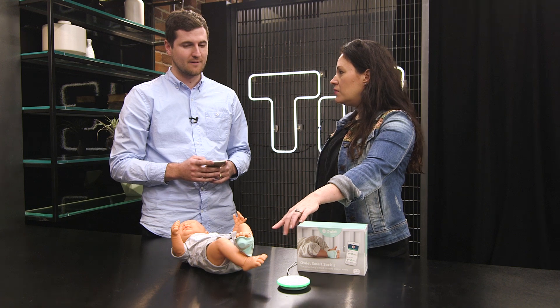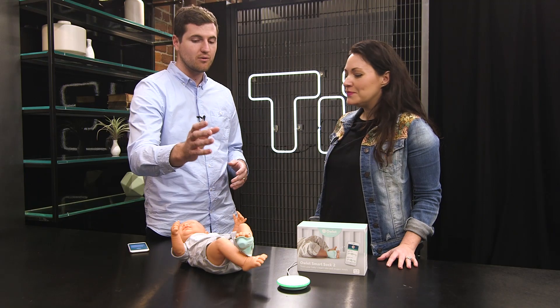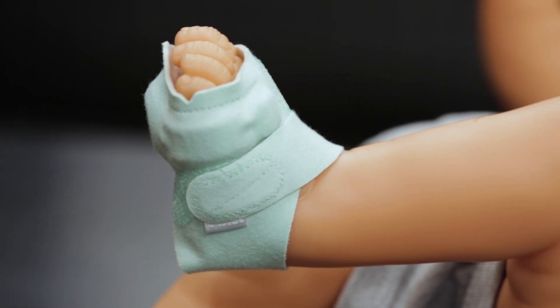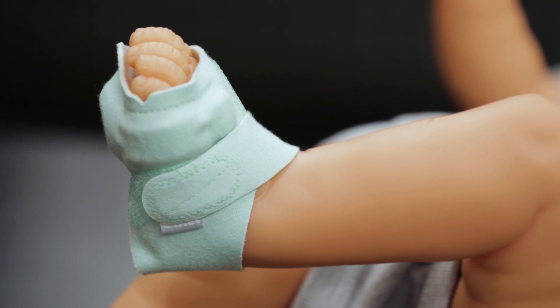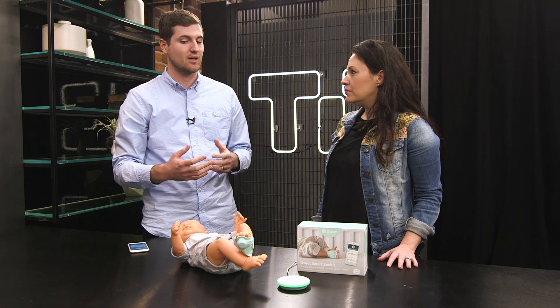What's different about this new sock versus the first version? The first big difference is the range between the sock and the base has increased dramatically — we've seen 10 times the range. Also the form factor has changed significantly, so you can have it on the left foot or the right foot. It fits better on newborns and preemies, and so we see a lot less false alarms.